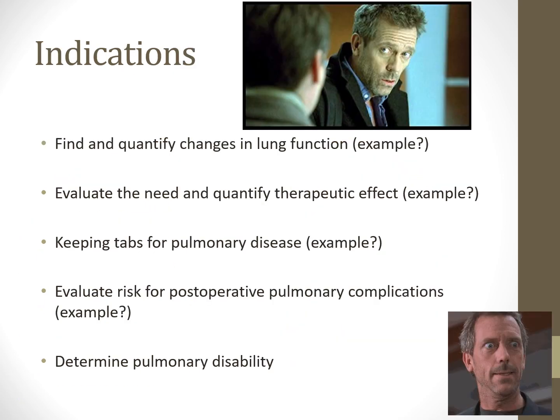So what are some indications for this? When we're looking at indications, well, we need to find and quantify changes in lung function. That's one of the things that we'll have to be looking at here, or evaluate the need for a therapeutic effect, like someone that has asthma, right? Do they need an albuterol inhaler? Do they need a steroid inhaler to help control any inflammatory issues? If it's extrinsic asthma where it's allergies that cause it, do they need anti-allergy medication or antihistamines, right?